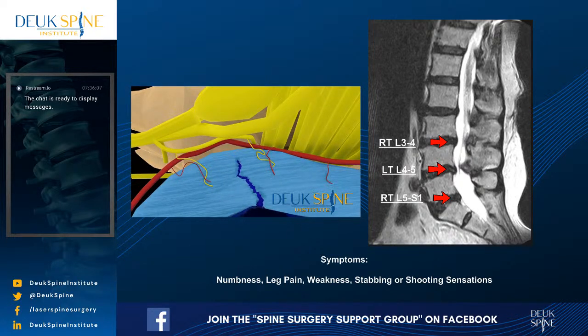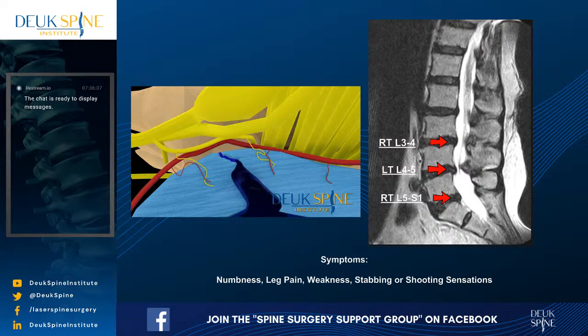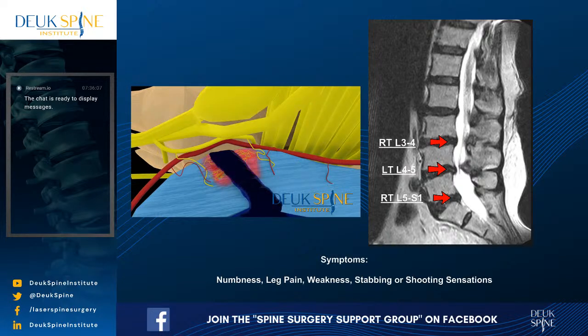Let me just talk to my patient for a moment. Okay, we're ready to get started, okay? Sarah? We're ready to get started. All right, just lay still. I'm going to give you some numbing medicine, all right? If you feel pain, say ouch, but don't move around. All right, Sarah?